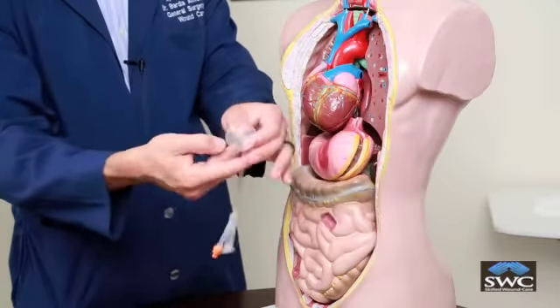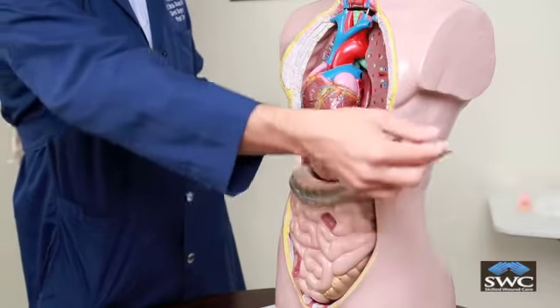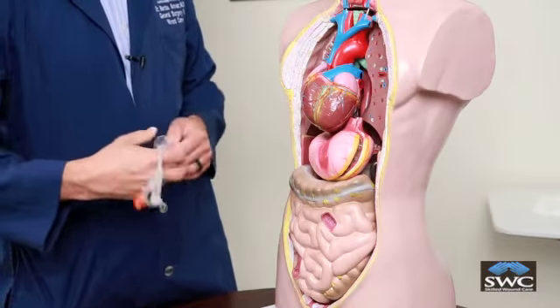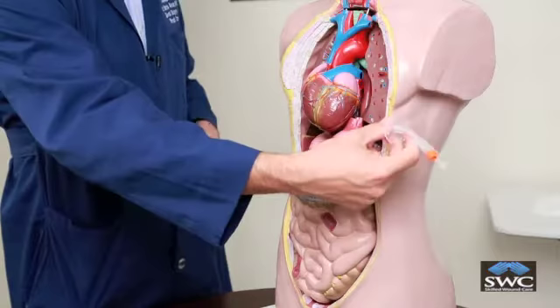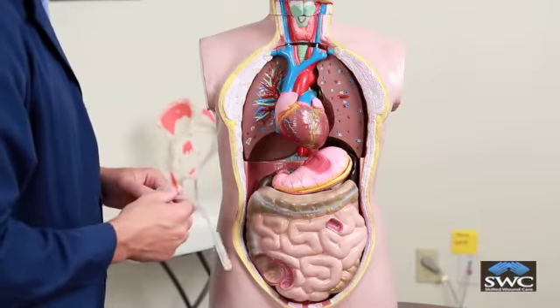the PEG tube will usually have a button at the end. If it comes out of the stomach, do not attempt to replace the PEG tube and refeed the patient. If you do so, you may be refeeding the patient's peritoneal cavity, and it can be a surgical emergency.